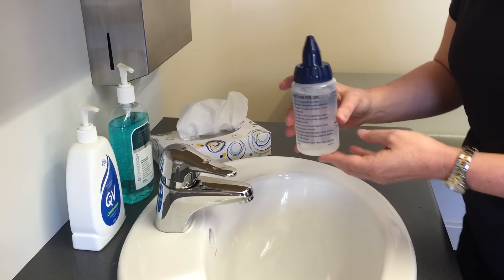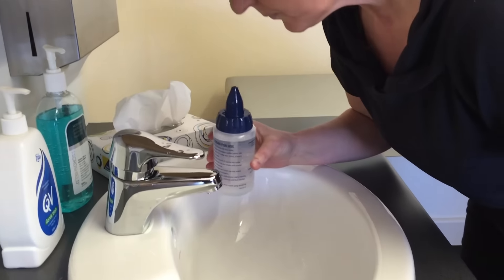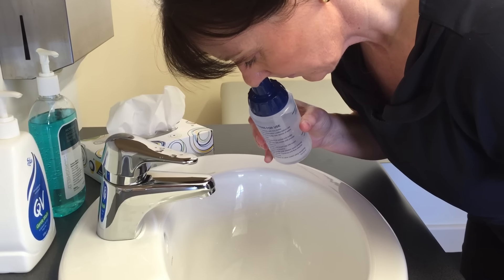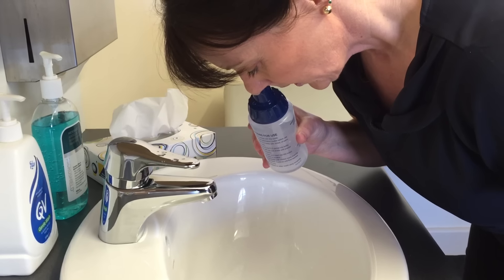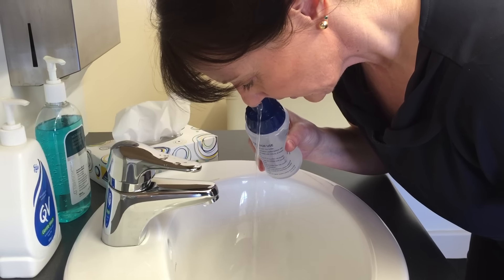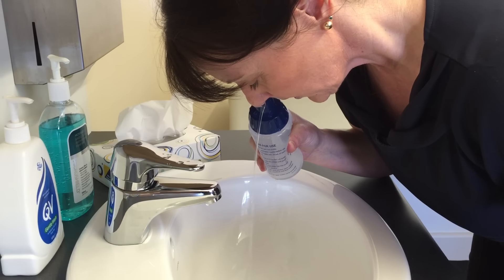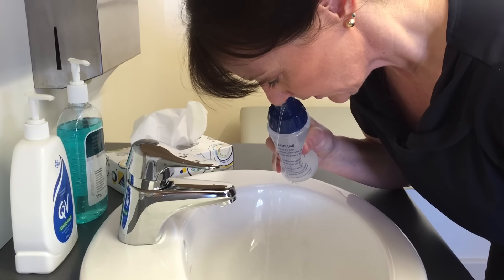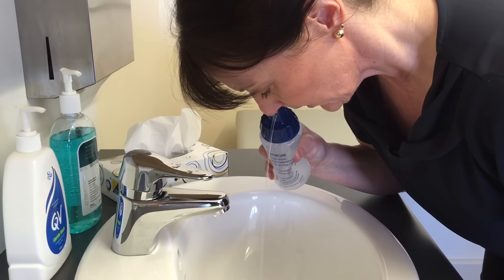Then lean over the sink with your face looking at the ground and insert the tip of the bottle into one nostril. Breathe through your mouth while squeezing the bottle. The salt water will enter one nostril and then come out the other side. Keep breathing through the mouth to prevent the salt water entering the throat.